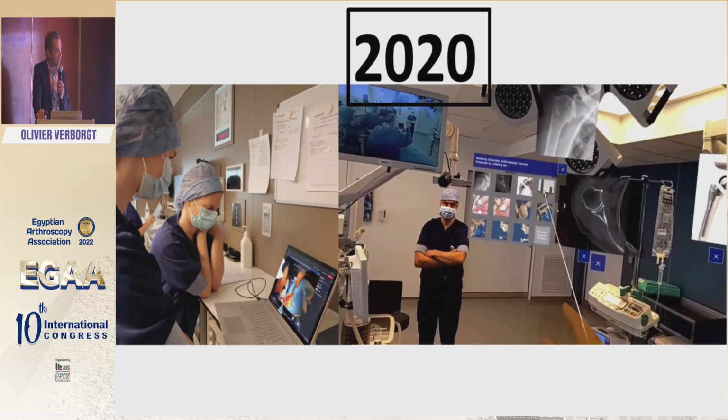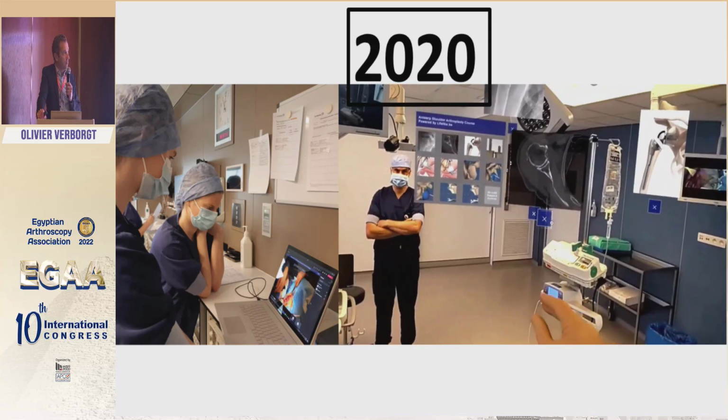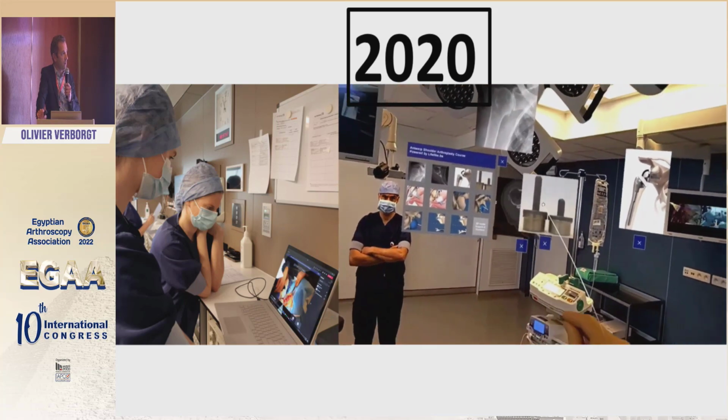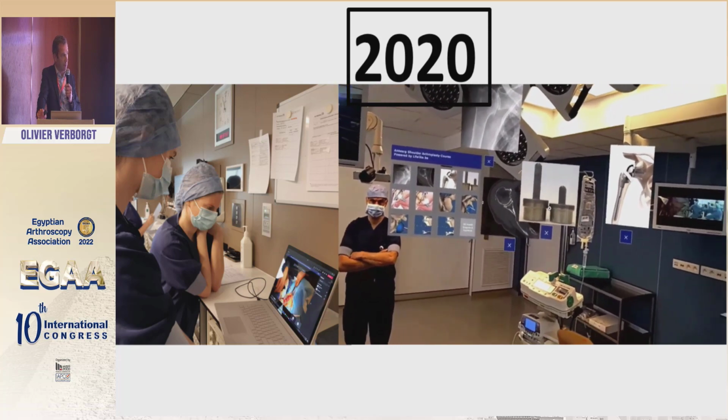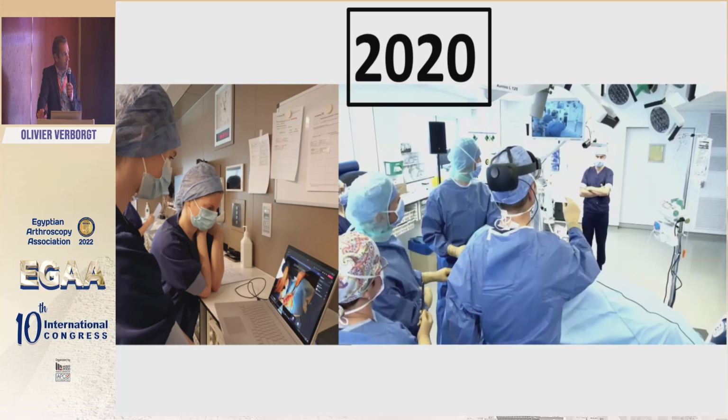I'll decide later on how long the central peg should be. I planned for 25, and I think this will probably be the best way to deal with it.